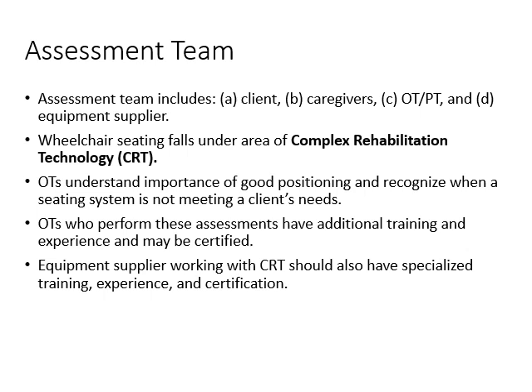Sometimes there are off-the-shelf products, which are durable medical equipment, that can be used for a patient, but most of the time a patient needs personalized adjustments, and it is our job to make sure that the wheelchair and the seating system are specific to our patient's needs. The moment things need to be adjusted and adapted for this person, it's considered complex rehabilitation technology. Of course, as occupational therapists, we understand the importance of good positioning and postural alignment, and we recognize when a seating system is not meeting the client's needs.